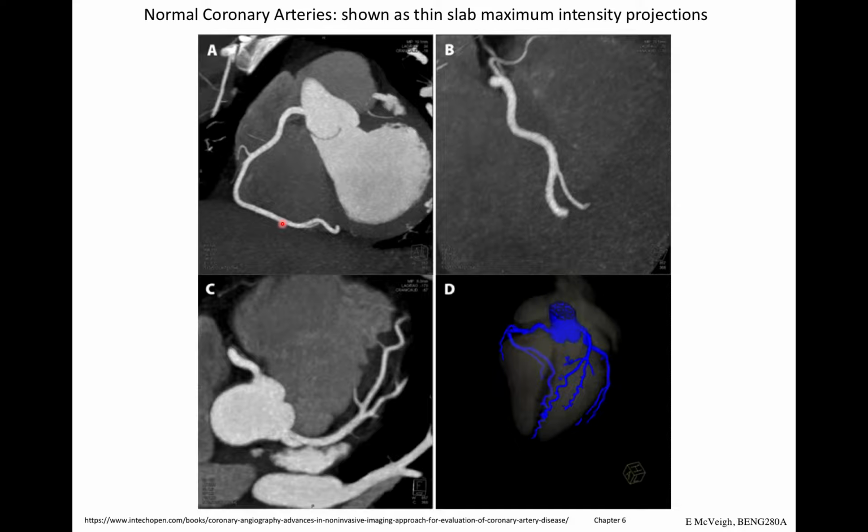And coronary CT has a 99.5% negative predictive value. So that means when you call somebody normal, they are normal. It's very hard to make a normal-looking picture if you're not normal, right? Vice versa, it's different, in that there are a number of ways in which you can make a picture look abnormal when the person is in fact normal, but the reverse is not true.